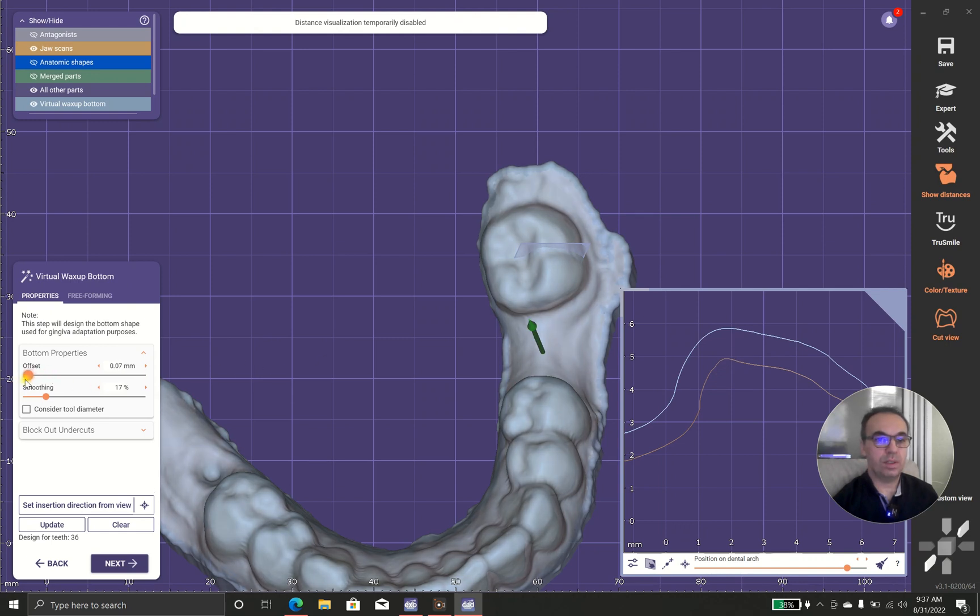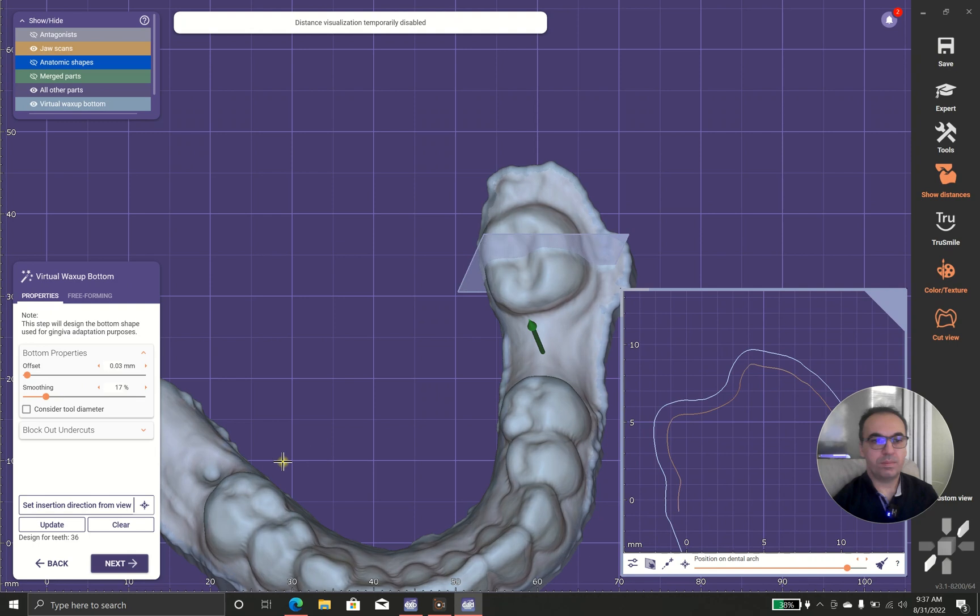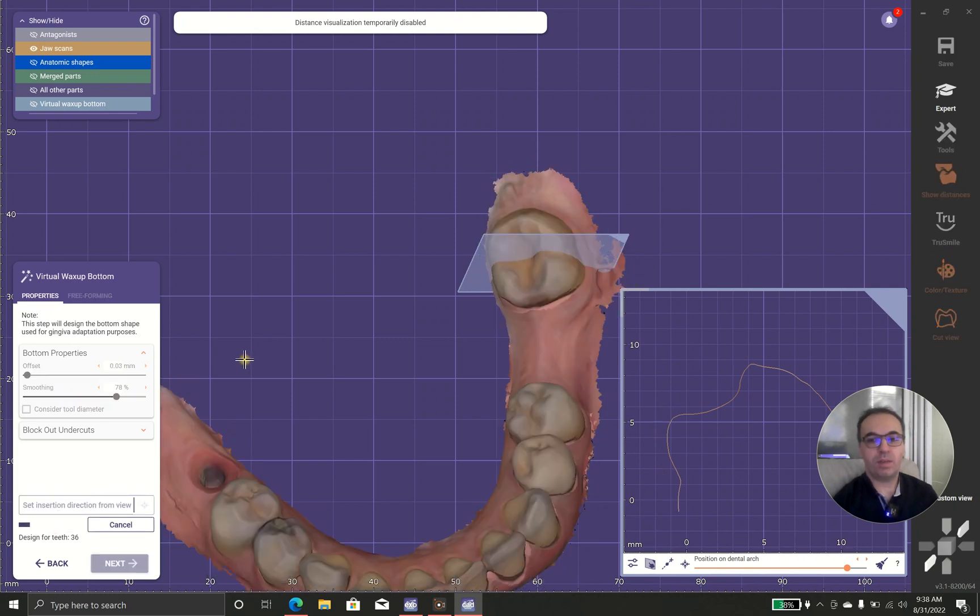And what if I do the smoothing? Look at these indentations and look what happens in case I increase the smoothing.